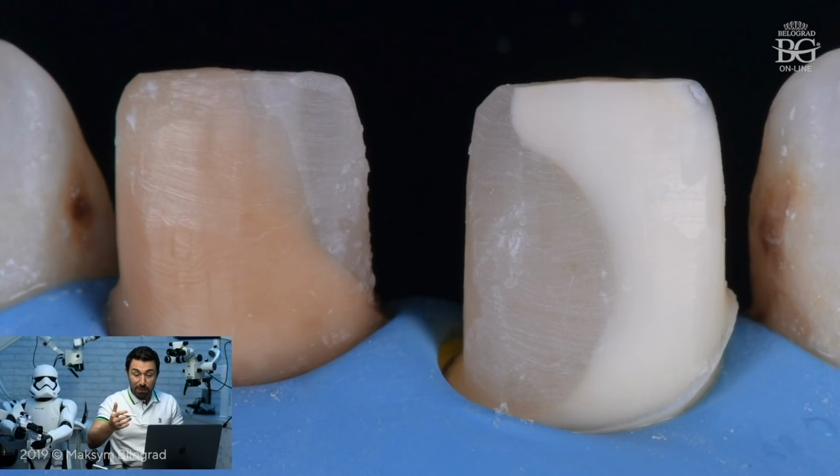Actually, I posted this picture recently on my social media, on Instagram and Facebook, and some people said that this is Photoshop, because it is impossible to have that level between rubber dam and tooth surface. How can you prep teeth with rubber dam in such a way without getting this helicopter effect and tightening of the rubber dam over the bur when you are preparing teeth?